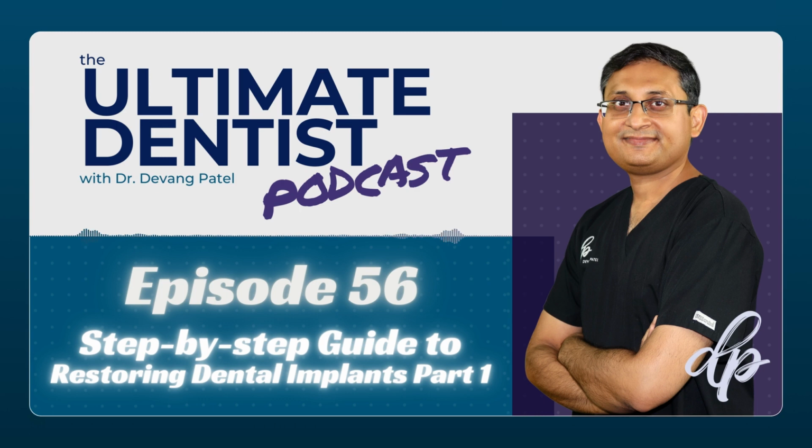Having said that, the biological implication of occlusal overload is quite debatable. Some studies say there is a biological reason, some studies don't support that. But we know that the mechanical issues are definite when you have occlusal overload with implant restoration.